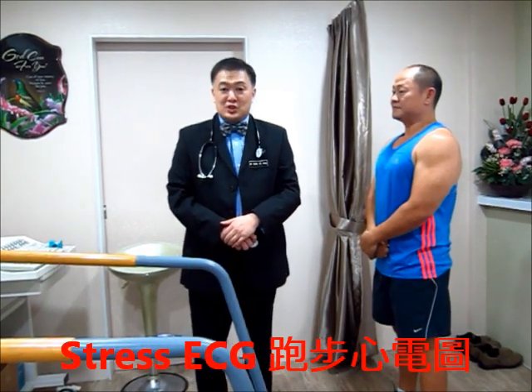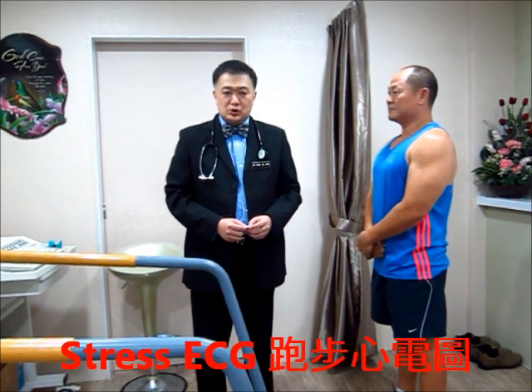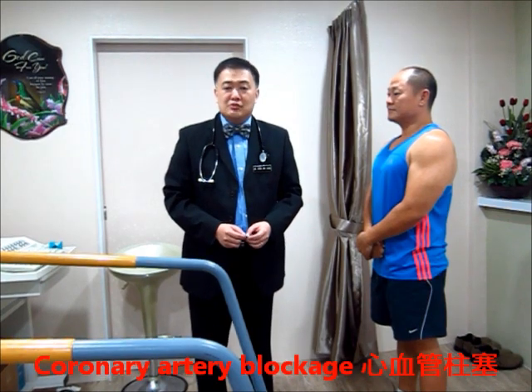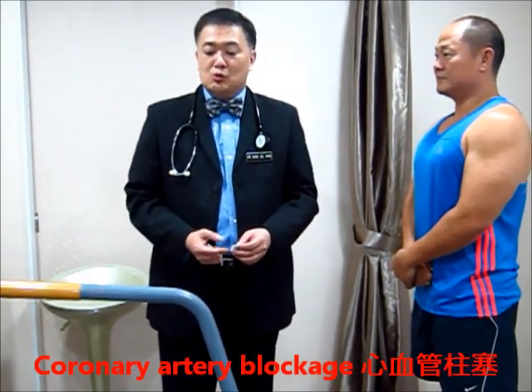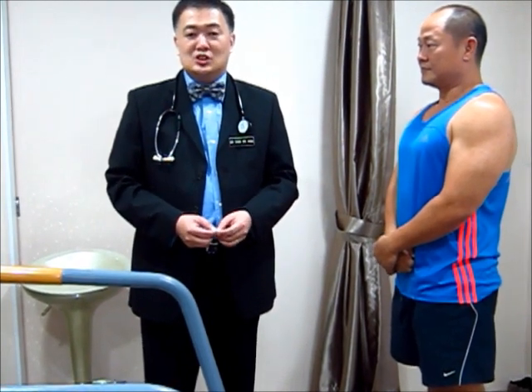We are about to do a stress ECG. Most patients come with chest pain and want to know whether the pain is due to blockage of the artery of the heart. This is a very common test that I do every day — roughly 5 to 12 stress ECGs daily. I'm going to demonstrate how I do the stress ECG.